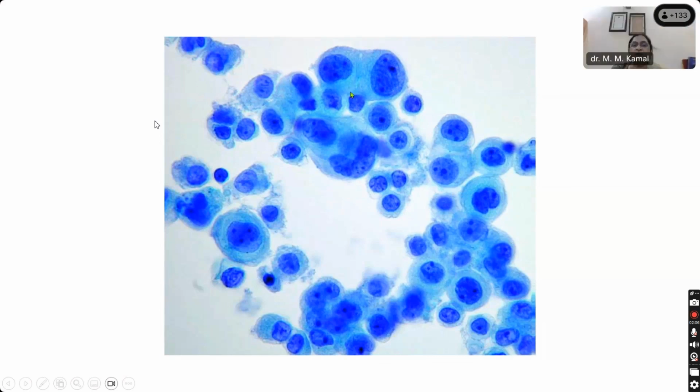So this cell is pretty abnormal. This is also very abnormal. Yes, ma'am. Here again, you have larger cells with larger nuclei, more cellularity, more number of nuclei. So everything is big, big, big and more in numbers in mesothelium. But as we have seen, even the reactive mesothelial cells can become very bad, sometimes creating suspicion of malignancy. So would you like to call this suspicious for mesothelioma, or just straight away put it as malignant? Suspicious for, you feel that you can call it suspicious for mesothelioma.